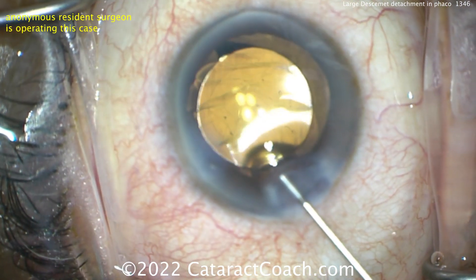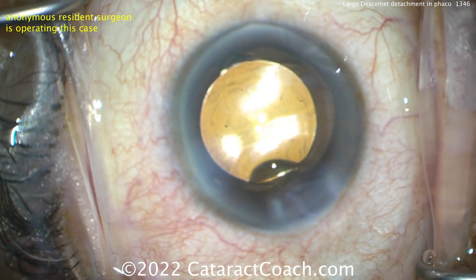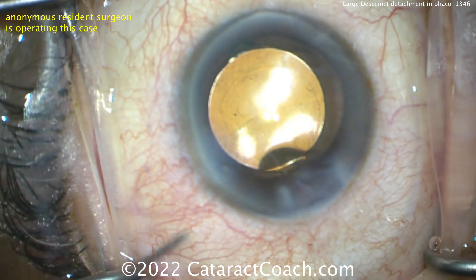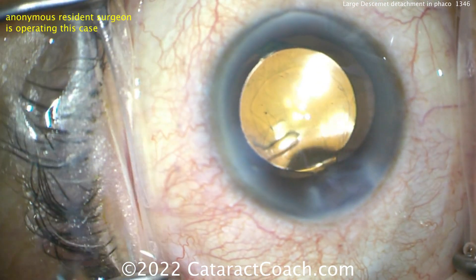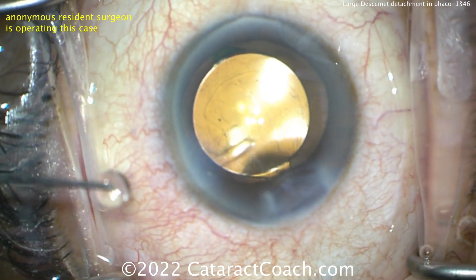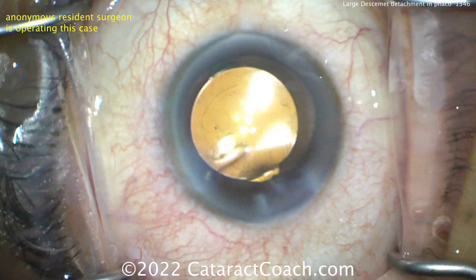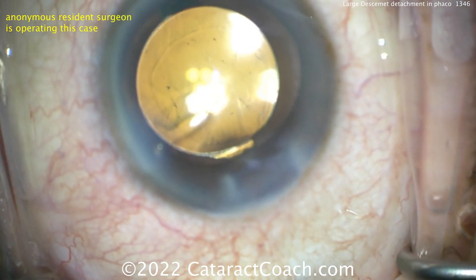More viscoelastic is being placed in the eye, though I'm not sure why that would be helpful. Don't leave viscoelastic in the eye — so that's going to be removed. There's a big loss of Descemet's right there, right in the visual axis — a big strip right down the middle. Both the attending and resident are facing reality: there's no Descemet's flap anymore in the center. You can't do anything — you've got to close up the eye. Seal up the incisions and the main incision.